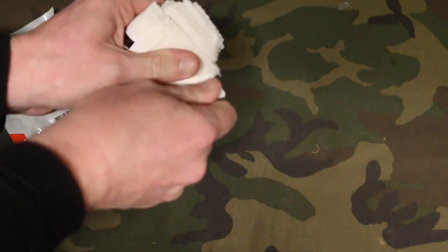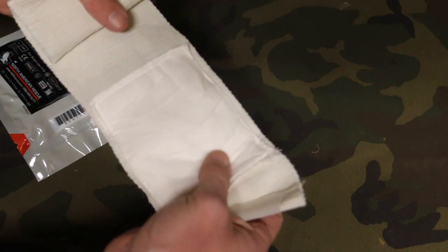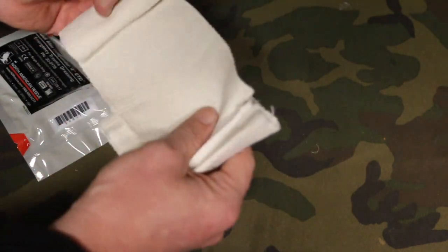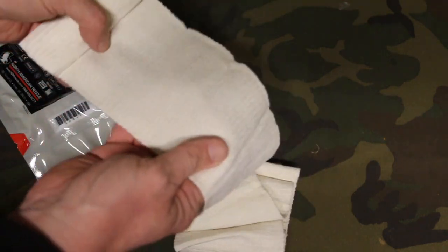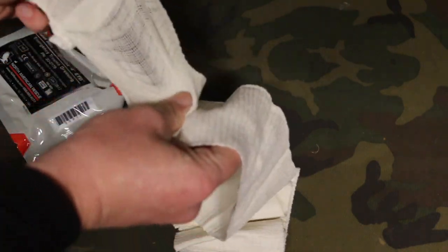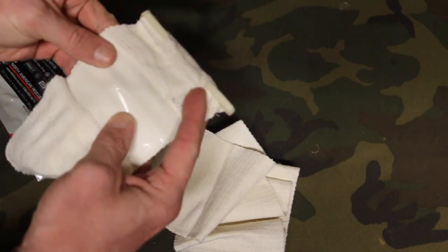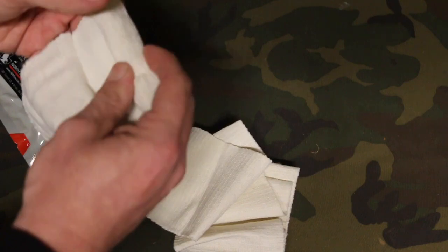You have a 4 by 6 gauze pad here — this is what's going to absorb the bleeding. And you have 42 inches of material here that's unstretched; you can stretch it to make more, but it's 42 inches of material. When you've finished securing it onto the wound, you have velcro and also a plastic clip that's going to help secure it.